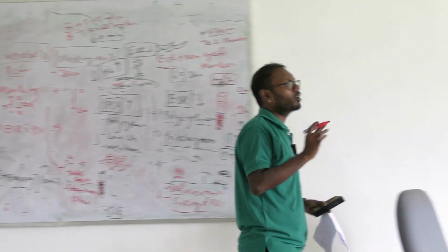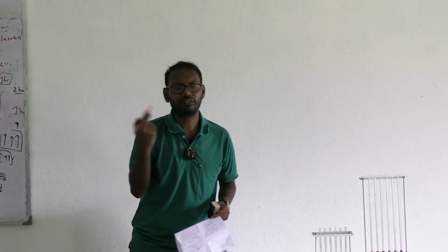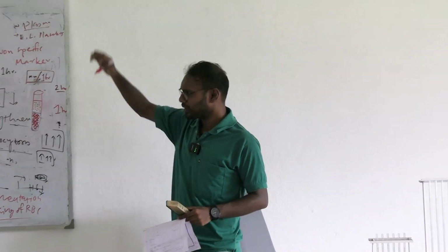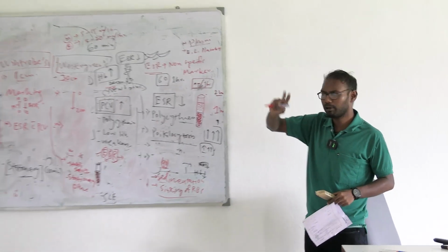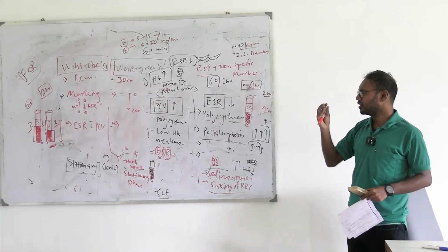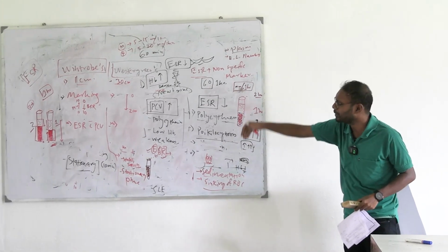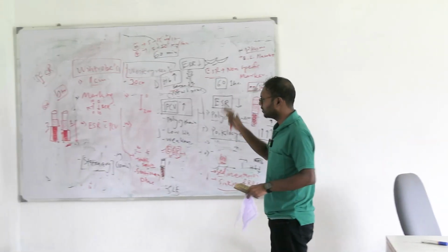In your class 11, 12 or even class 10, you have heard about centrifugal machines, right? When we centrifuge, what was the main purpose of centrifugation? To sediment, the same funda. After centrifugation, the fluid remains upwards, and all the main solutes are actually coming down and getting clumped to each other. So here the same thing is followed.